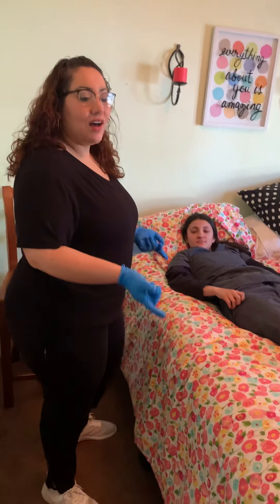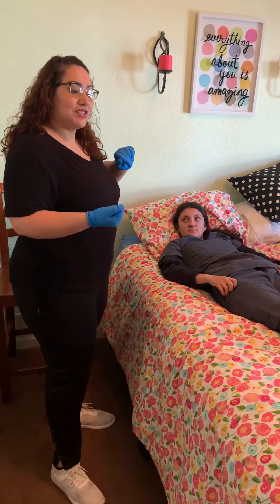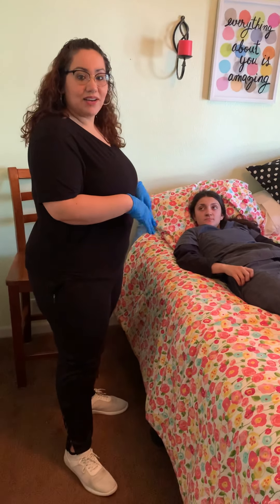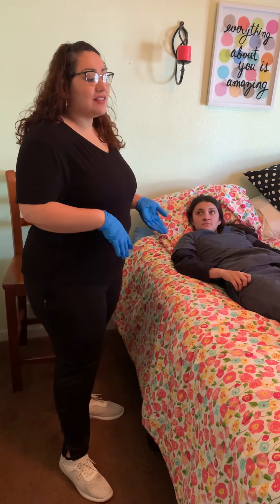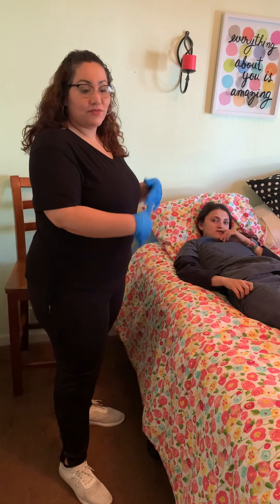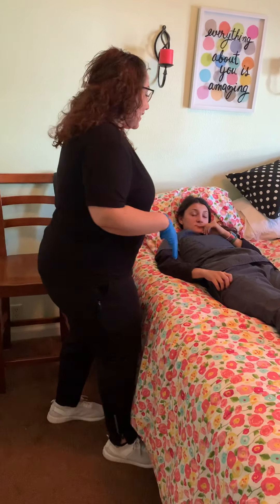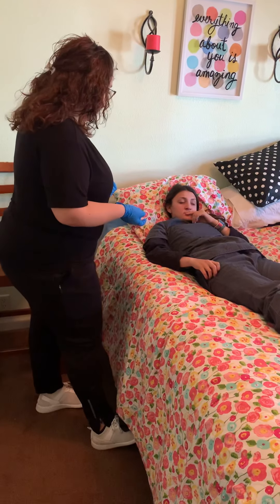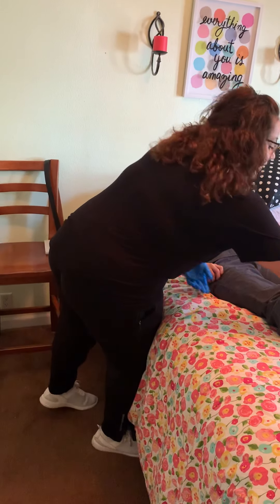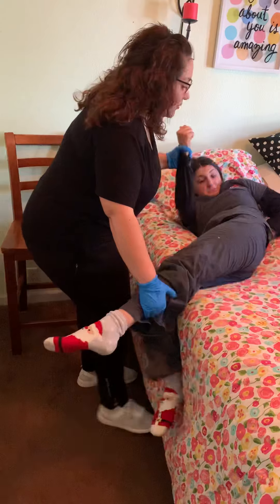Hi Maddie. My name is Karen Moniz. I am a student nurse. With me is my instructor. How are you doing today? Today I'm going to be taking you for a walk. We're going to walk a little bit, exercise the legs, the body. Is that fine? Does that sound fun? Can you please tell me your name — first and last — and your date of birth? Madison Gomes, 09/27/1999. Thank you. So it is my patient.